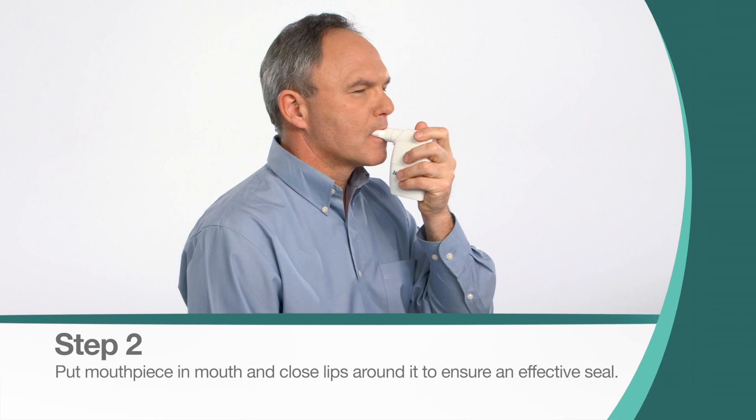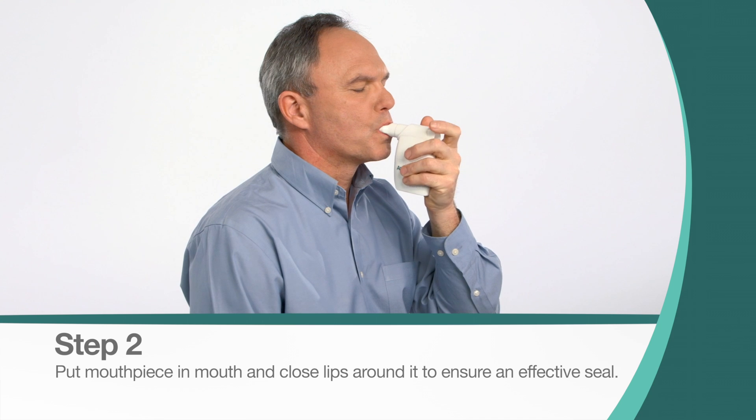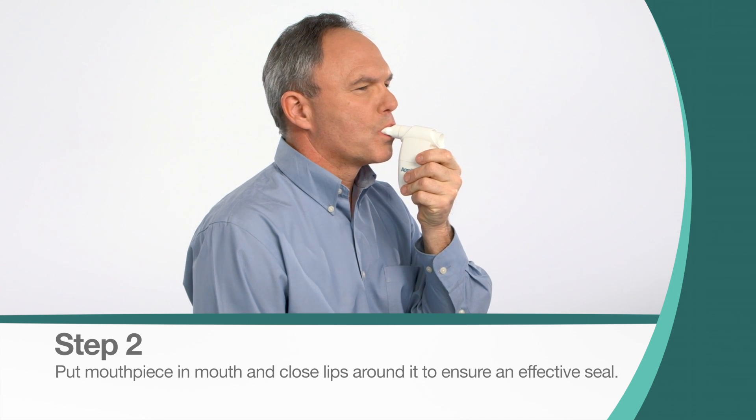Put the mouthpiece in your mouth, closing your lips around it, forming a good seal. Make sure your hand does not block the exhalation path on the back of the device.